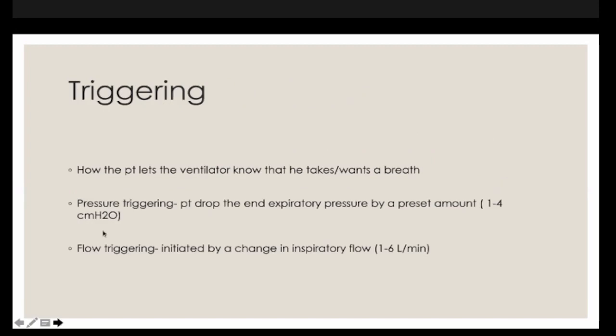So triggering. I was talking about triggering. Triggering means how the patient lets the ventilator know that he takes or wants to take a breath. There are two types: pressure triggering and flow triggering. Either the ventilator can sense the pressure, or it can detect the flow.